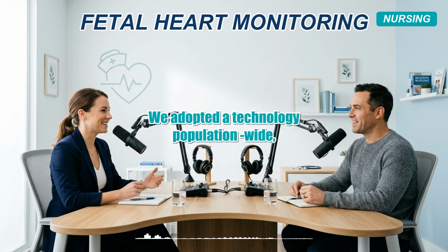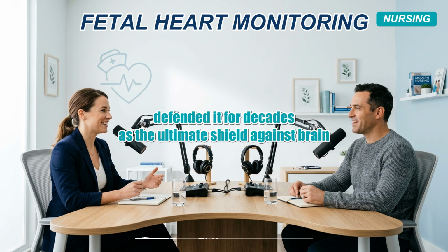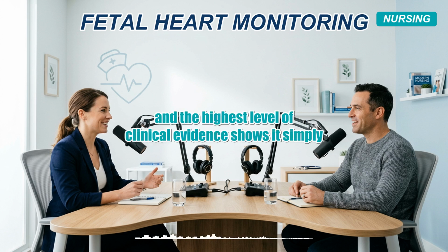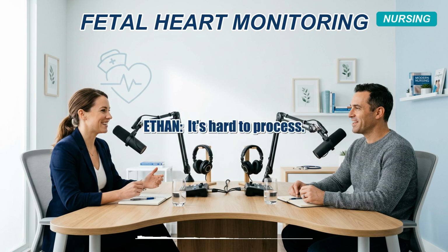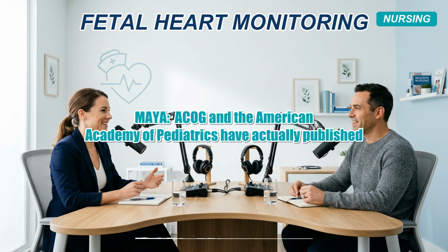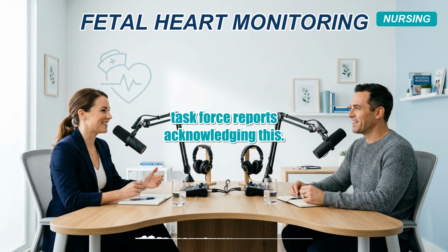We adopted a technology population-wide, defended it for decades as the ultimate shield against brain injury, and the highest level of clinical evidence shows it simply does not reduce cerebral palsy. It's hard to process. ACOG and the American Academy of Pediatrics have actually published task force reports acknowledging this.